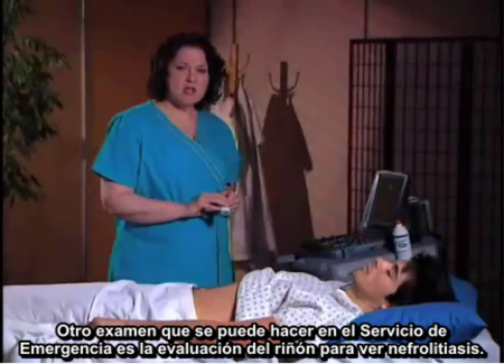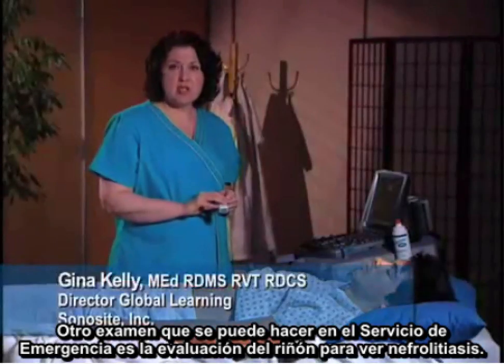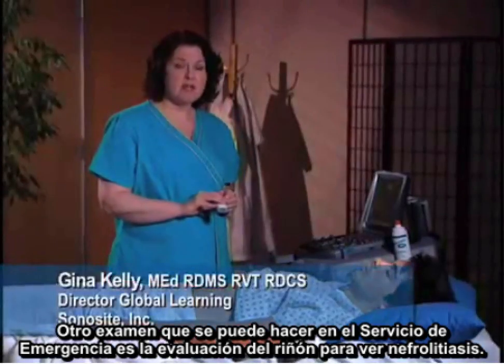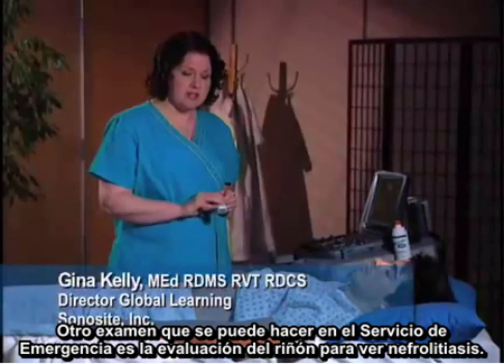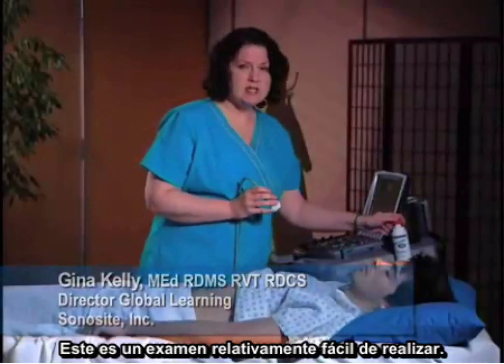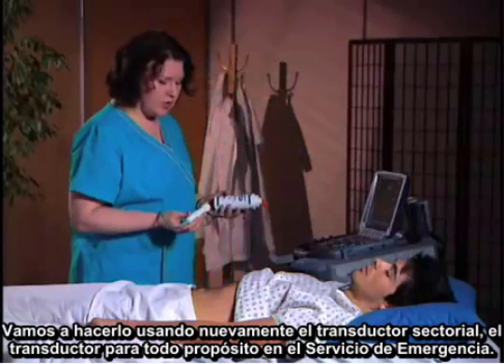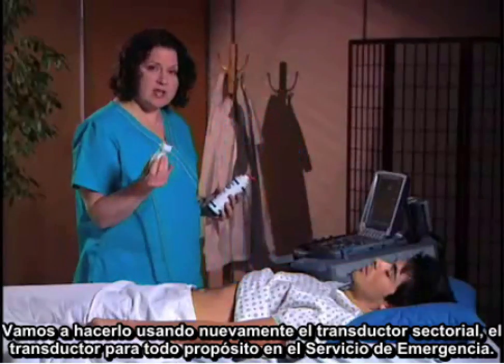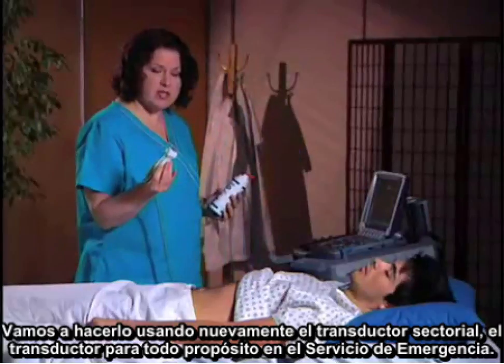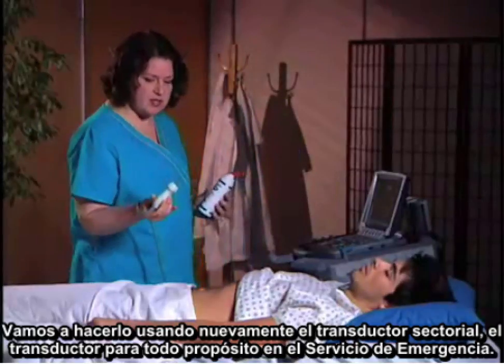Another examination you can do in the ED is the evaluation of the kidney for nephrolithiasis. This is a relatively easy examination to do. We're going to use the phased array transducer, your all-purpose ED transducer.